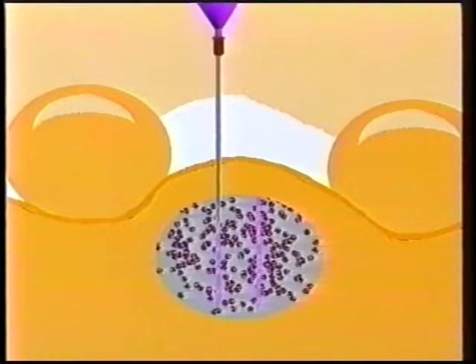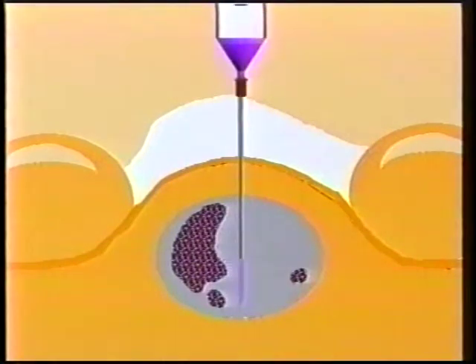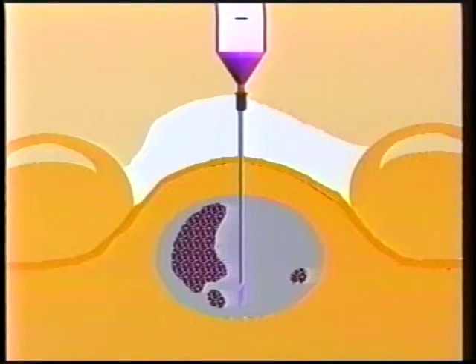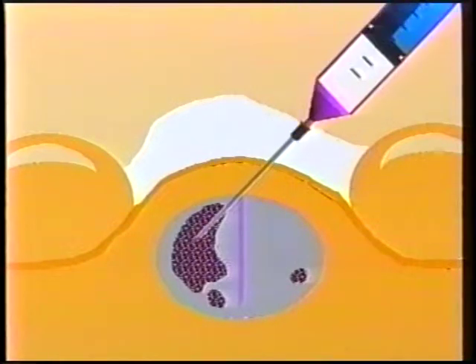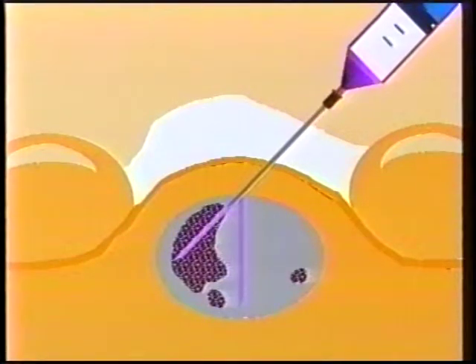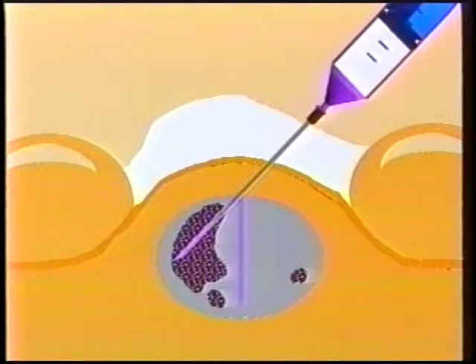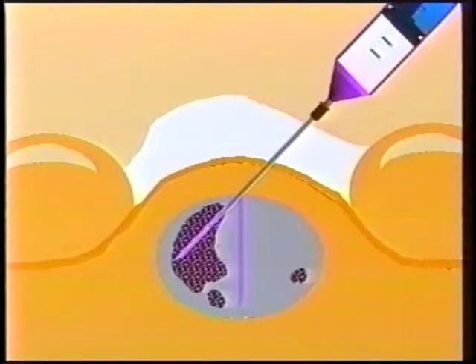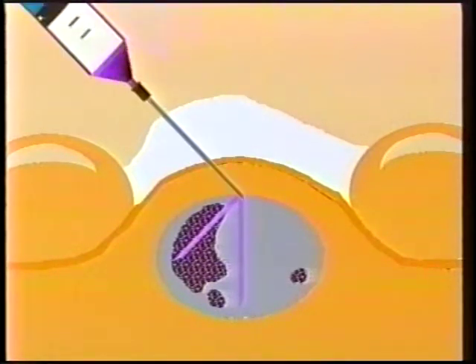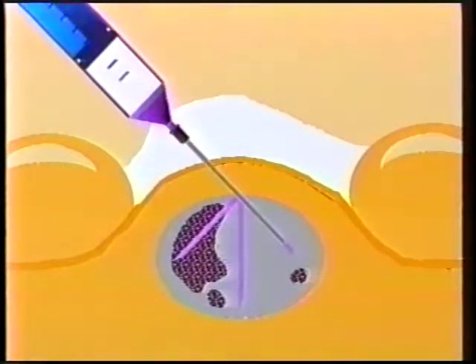In the case of larger targets, there is concern about the sample representing the whole lesion if only one area is sampled. The needle may then be redirected into several different areas. In order to achieve this, the needle, after sampling a given area, should be retracted to the surface of the target, redirected, and entered into a different area for further sampling.